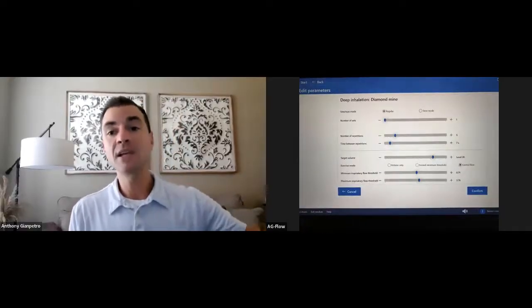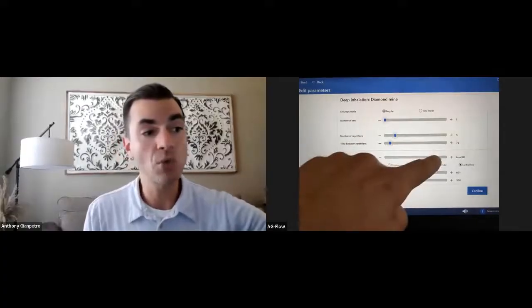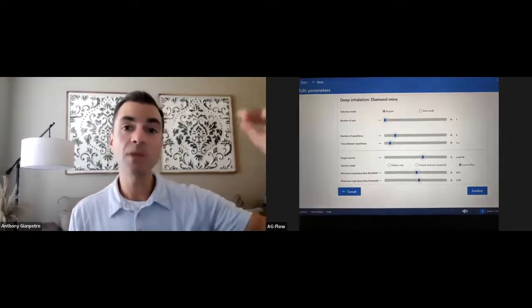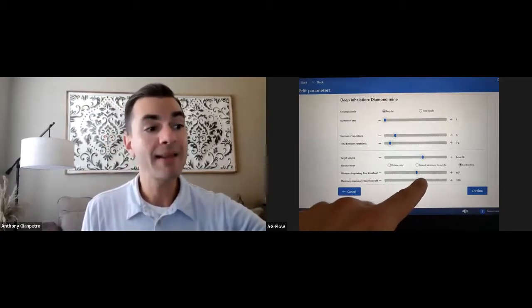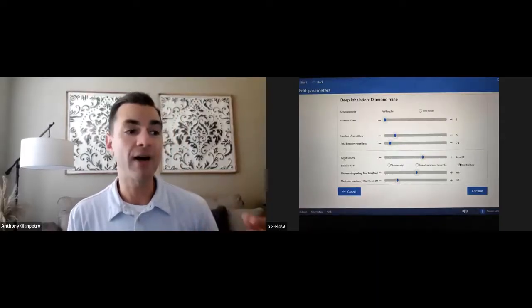And you'll notice that I wasn't quite getting the volume. The volume was a bit of a challenge for me at level 20. I can drop that a little bit, okay? And then that stalactite at the top didn't really seem to be a problem, but the one on the bottom did. And if you want to make that easier, just move it over to the left. And I'll show you what I mean by that as a final reference next.